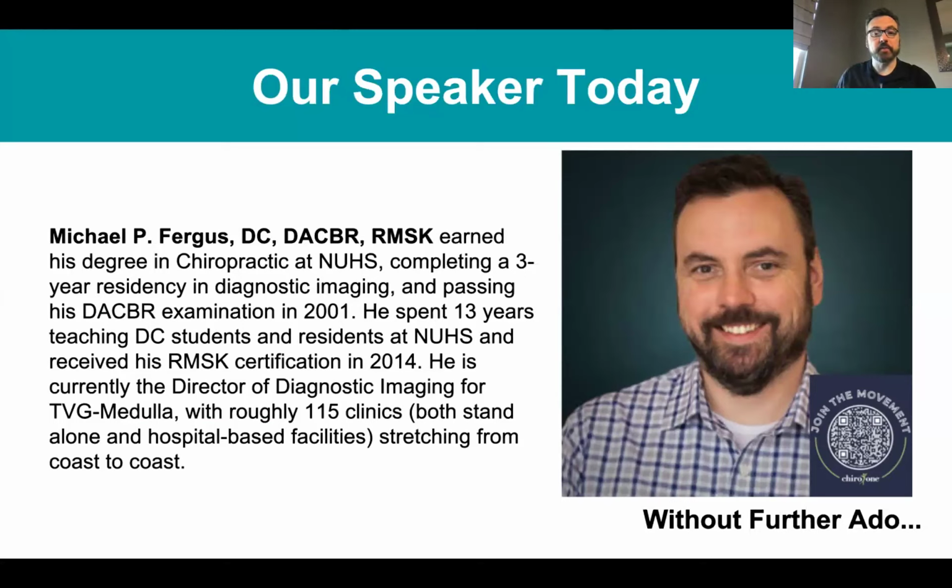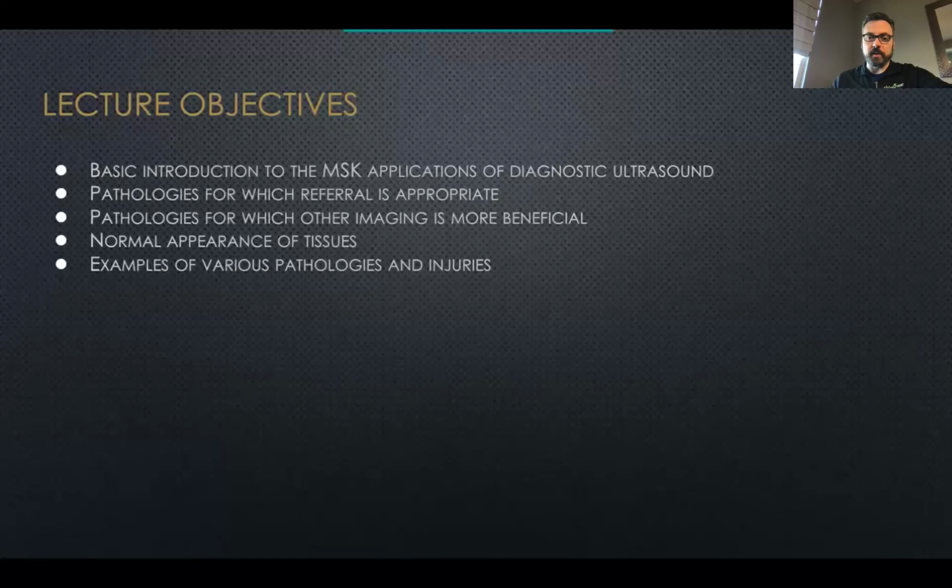Yeah, I was at National for like 13 years, teaching DC students and the radiology residents. One of the things that I had trained in and learned while there as a professor was musculoskeletal ultrasound and how it really is beneficial for the chiropractic practice.